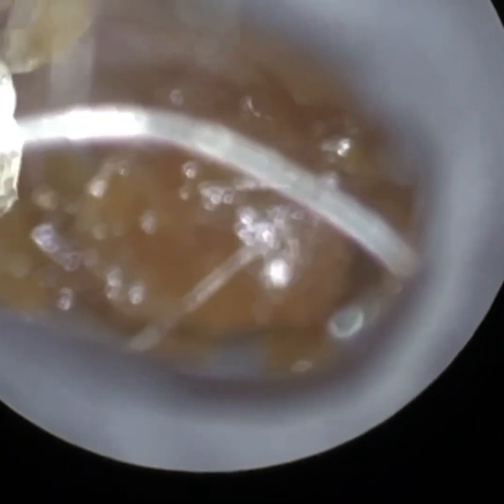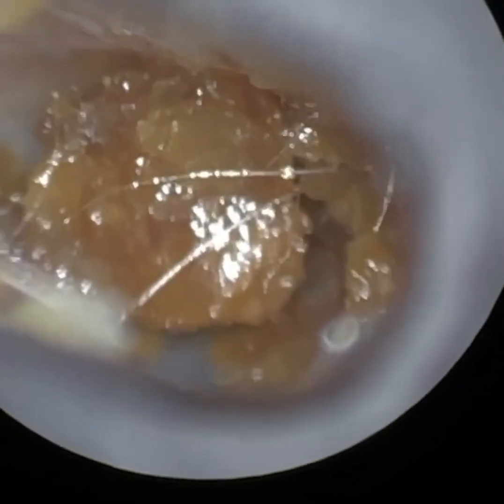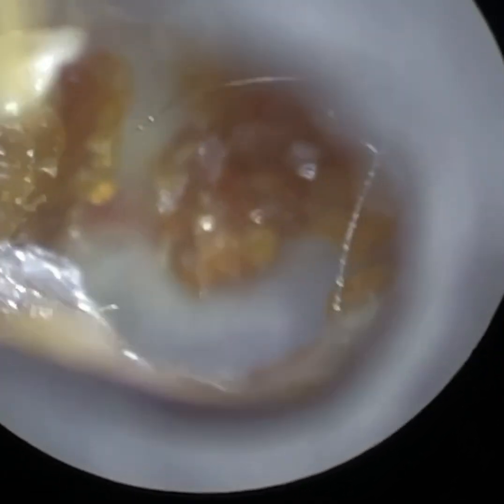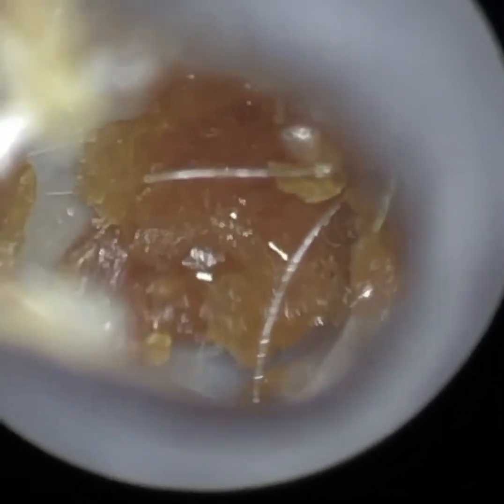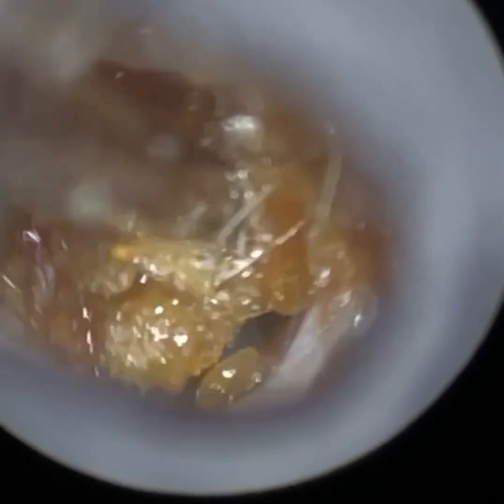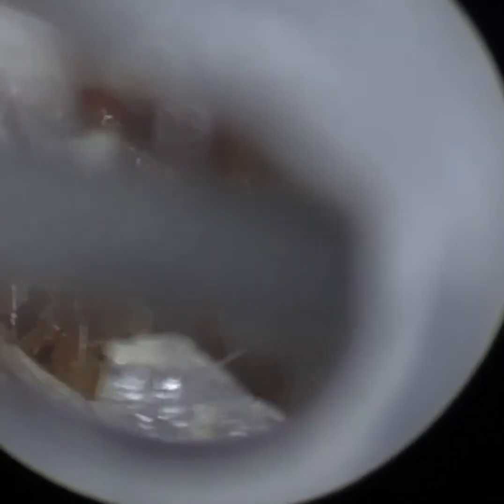Adjusting the focus is so easy — it's literally a slider on the app as you're in the ear, and it takes moments. That was one of the things I found really difficult with head loops and even a microscope. I would lose focus so easily if the patient moved. With a microscope, if you're having to manipulate it to visualise a different part of the ear, it's very hard. With the Waxscope, you just put the speculum in and adjust the focus with your finger. With the loops it was a double whammy — not only if the patient moved, but when coming out of the ear to remove wax off the sucker, you'd have to readjust your head position again. So it took a lot longer.